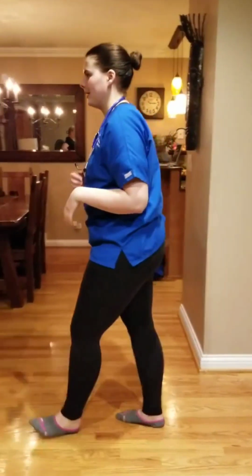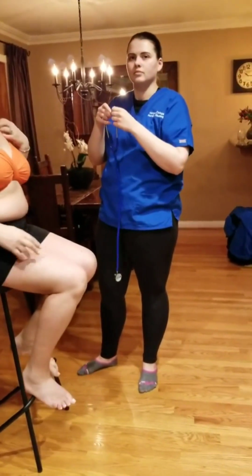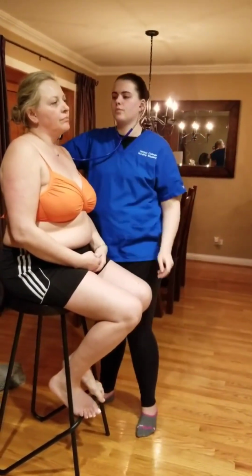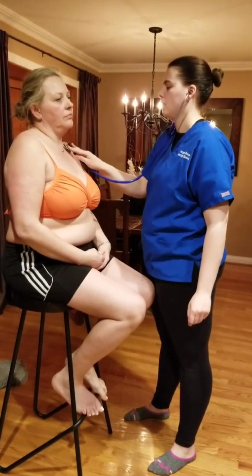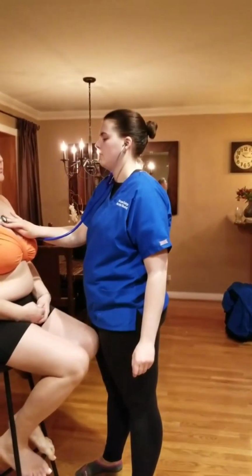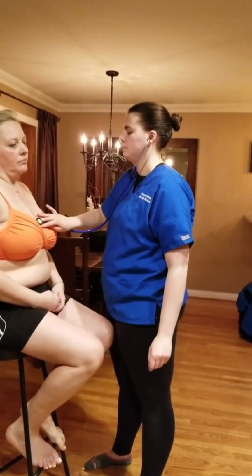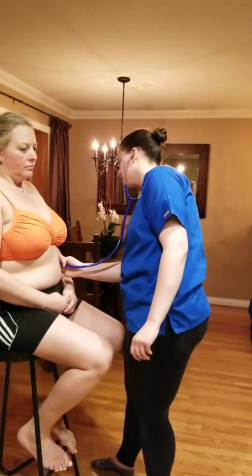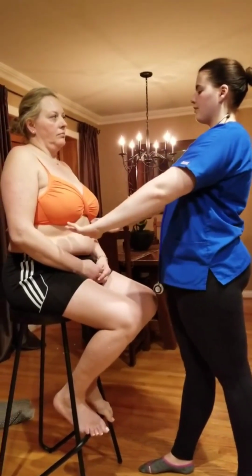To assess lung sounds. Okay? So please take off your shirt. Okay. And then the first thing I'm going to ask you to do is breathe in and out. I'm going to listen to your bronchial sounds. Okay? Breathe in and out. Okay? Okay. So here I heard bronchial sounds, here I heard bronchovesicular, and at the periphery, vesicular sounds.